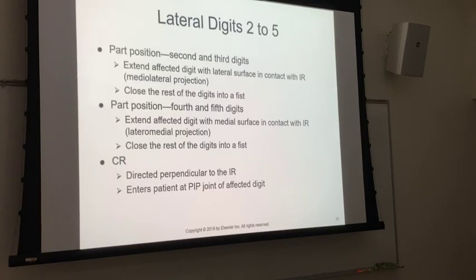It's a fuzziness, so I lose sharpness or recorded detail, right? So I want it as close as possible so our OID is as small as possible, right? But I also want it parallel, because if I have it tilted, so this thing is that long, right? But if I tilt it, how does it look now? Does it look longer? Does it look shorter? What do we have going on? It looks shorter, okay, so that's foreshortening.